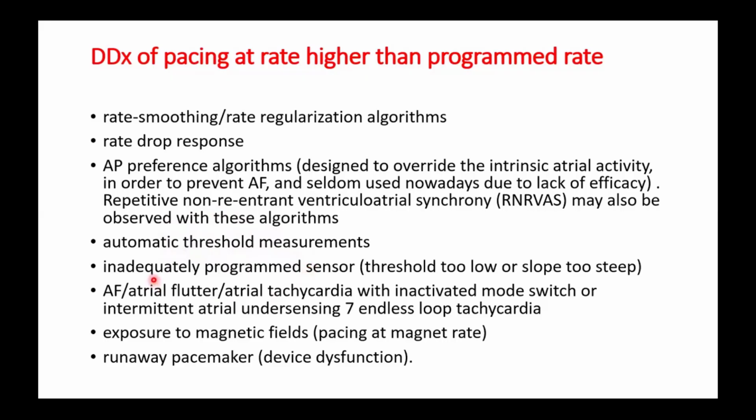Or when you are turning the sensor on and programming it very sensitive, or programming the threshold of intervention at a very low level. Or when a tachycardia, atrial high rate, or endless loop tachycardia occurs. Always remember that exposure to a magnetic field may trigger pacing at a magnet rate.